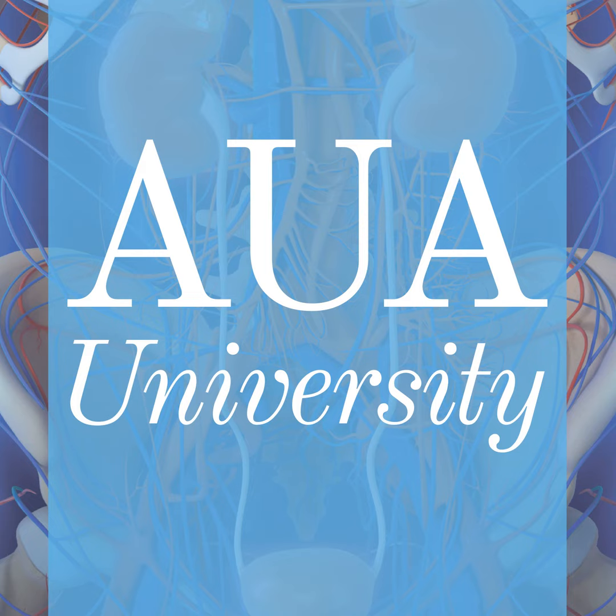So in summary, the gallium PSMA PET CT scan is the most commonly used tracer. I'll have to get the mouse somehow in there. It's the most commonly used tracer for the evaluation. The PSMA expression increases with biological aggressiveness of prostate cancer. And you have to remember, PSMA is not prostate cancer specific. It can be positive in benign and in malignant disease.